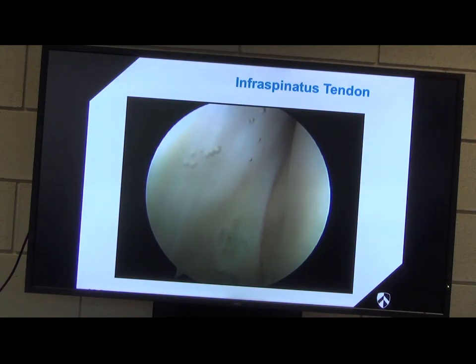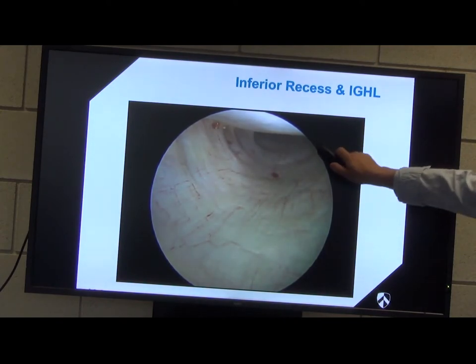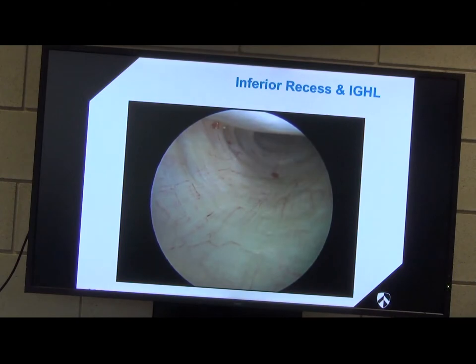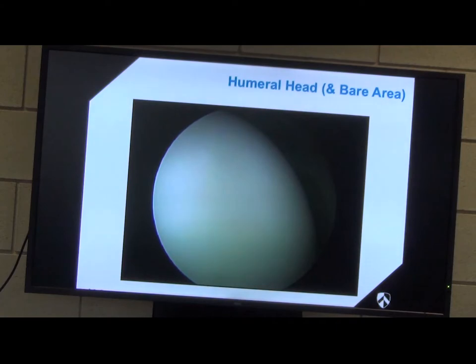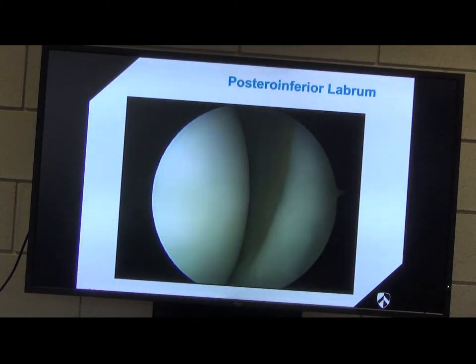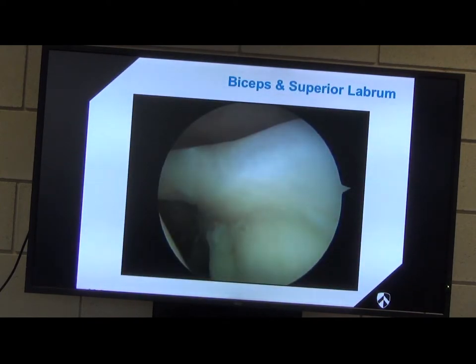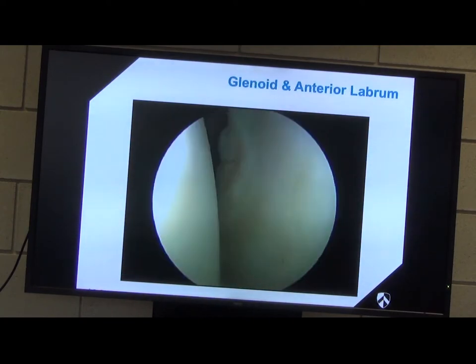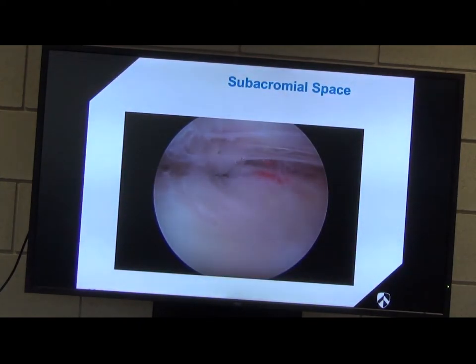This is the infraspinatus tendon — now we're looking at the back of the humeral head. That is the inferior recess. This is the attachment of the inferior glenohumeral ligament. So if you have a HAGL — humeral avulsion of the glenohumeral ligament — it's going to fall away from the humerus and away from the articular margin. Humeral head articular surface. You can rotate the humeral head to look at all portions of the articular surface. The posterior inferior glenoid labrum, then the recess posteriorly, superior attachment of the biceps, the anterior part of the glenoid labrum, anteroinferior, and then the subacromial space — we're actually inside the bursa there.